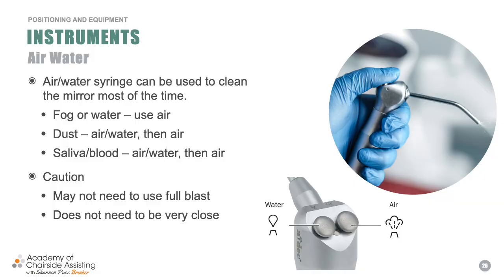All right? Now, this is where we got to get used to using the air water syringes. And listen, every practice's air water syringe is different. Every piece of equipment is different. So you got to practice. If I taught you today how to use the air water syringe in my office and then you went to a different office, they're all different. The pressure is different. The air is different. The water is different. Trust me. So one of the things you want to get used to is how much air is going to be coming out of that air water syringe, how much water, and then what happens if you push the button and you're going to use both.